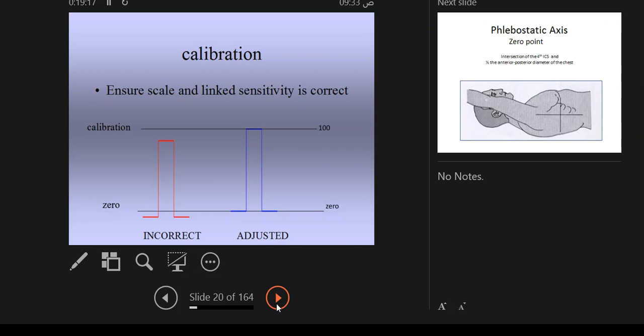If I tell him to put the 40 millimeters mercury, your left ventricle will go up into the sky, because that part is only 40 millimeters and you have 120, so 3 times that to get up to. And sometimes when the left ventricle pressure is very high, like in aortic stenosis, I ask him to put the calibration on 200, so I can measure my ventricle properly inside this. So this from 0 to 200 is in that space. That's what is meant by calibration.